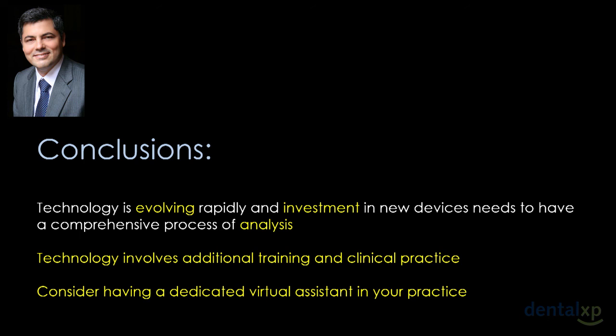And it brings another fact, and it is the fact that you are probably going to need a dedicated virtual assistant in your practice. You might either want to have an additional employee that is going to be somebody techie with a background in design, or you might actually have to make an agreement with a company that will remotely access your computer and make all that design. So all you have to do is load the cartridges, load the blocks, and these people are doing everything from Atlanta, from Arkansas, from Texas, from whatever part of the world.